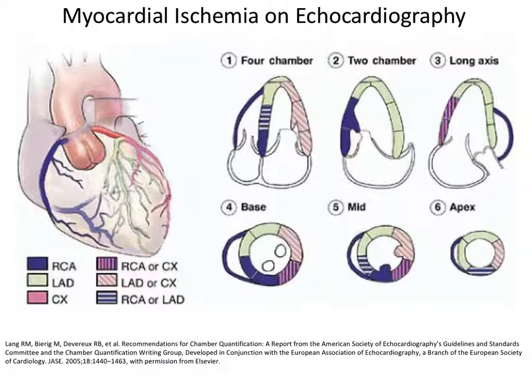Say that again? Well, I could get my catheter stuck against the hard wall. That's a bad thing, but it's not the worst thing that could happen. Let's just say I'm watching on the fluoro. I've got my catheter on the thrombus, right? And we're in the left atrium. What's the worst thing I could see?